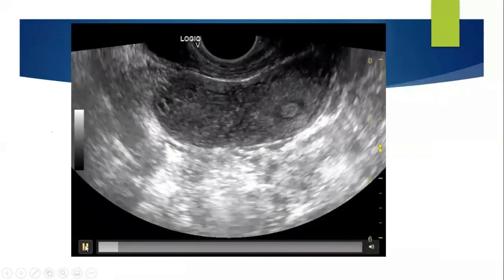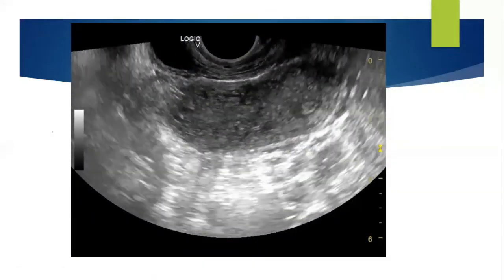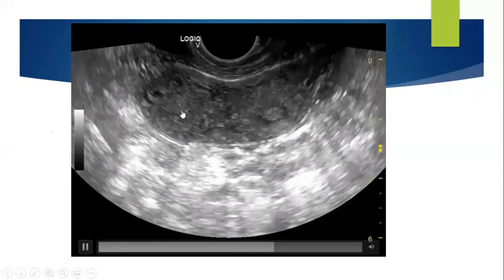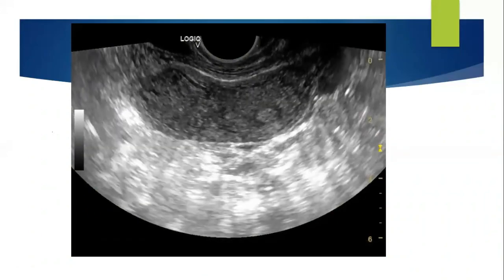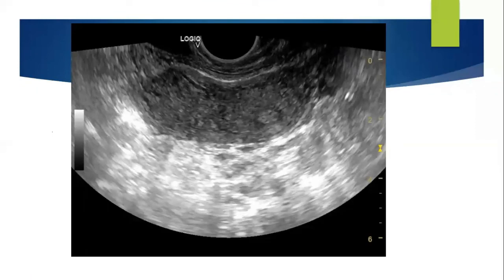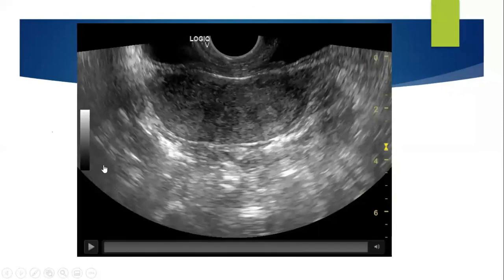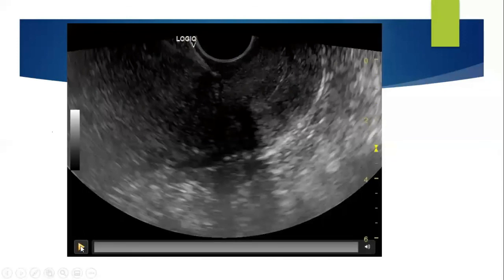You yourself will see and tell me that how on transverse section we can see that the transverse section of the uterus is looking much more broader, and you will see two endometrial cavities on each side. Okay, so this is a screening method. You can say 2D is a screening method to rule out, and this was a case of a septate uterus. A septate uterus when we checked with the help of a 3D picture, which of course at present I'm not able to show you.